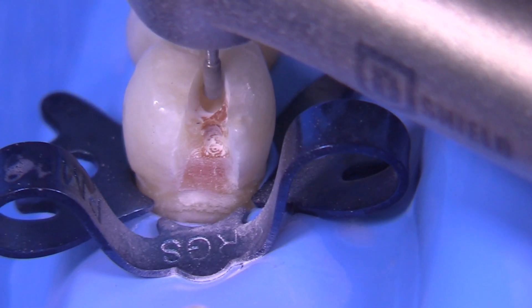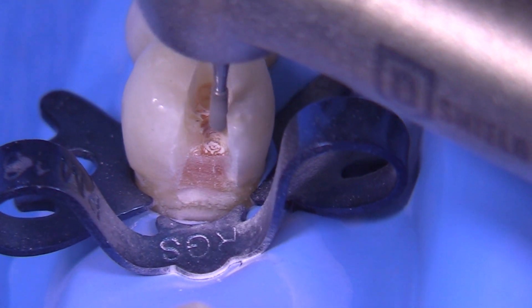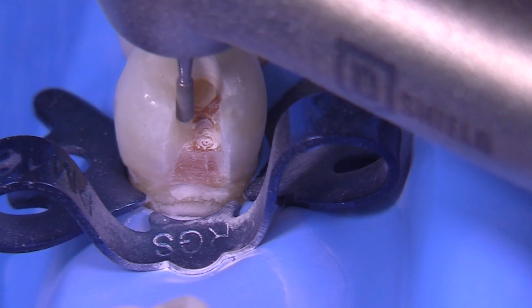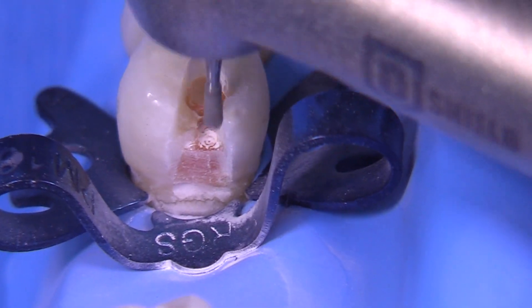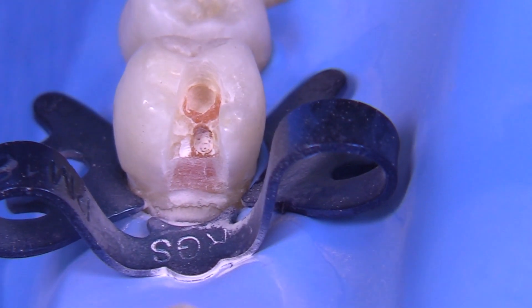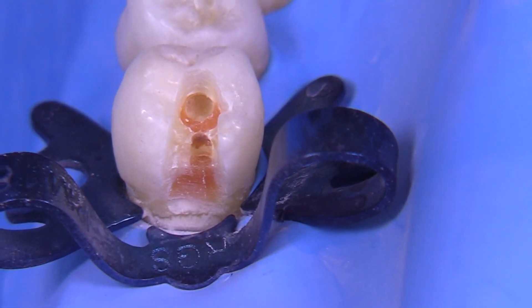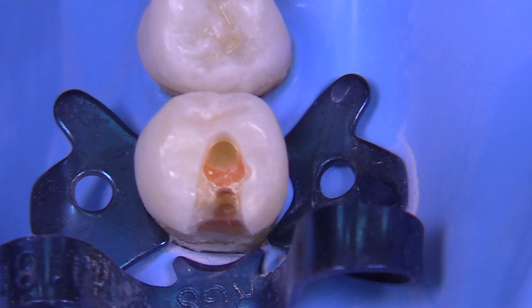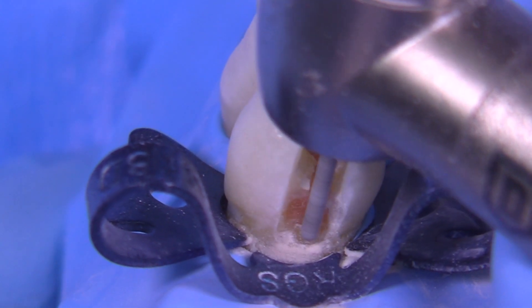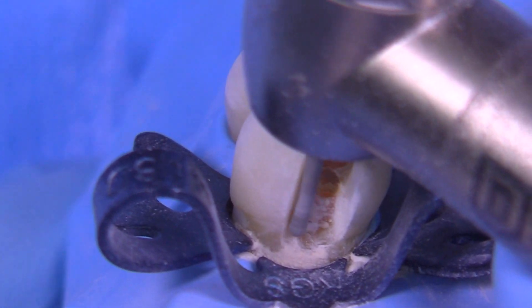Look at the caries in this tooth — pretty significant. We're actually quite concerned about the pulp in this particular case. This is not an unusual finding; we're working on a premolar that may have been adjacent to a molar that had to be extracted because of decay or a fracture, and we're restoring this before we move on to an implant.